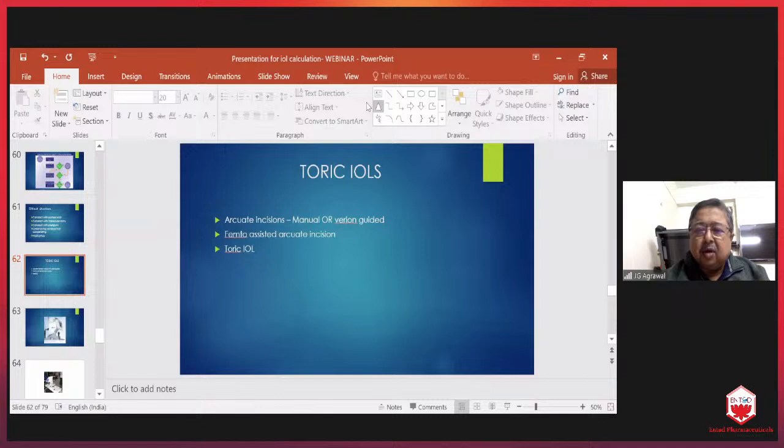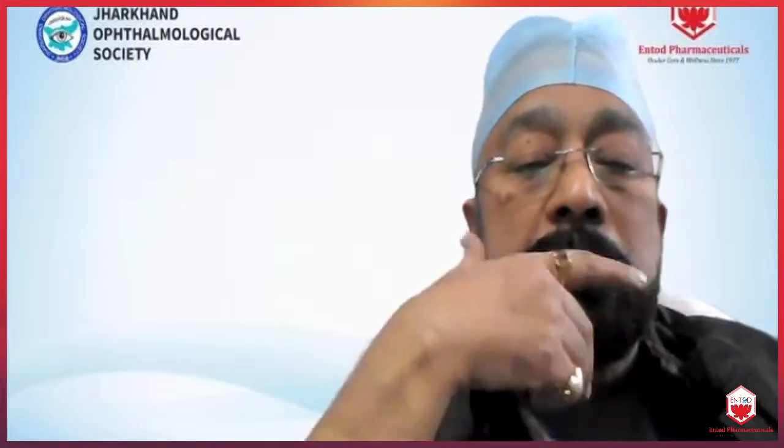Thank you, Dr. Kashyap, for your elaborate presentation on biometry. Actually, there are two aspects of biometry. First is the ocular measurement. Another is the formula which should be applied. First we go for the ocular measurement. I want to ask the panelists also, Dr. Aishwarya Rajdas, whether we should go for optical biometry or stick to ultrasound biometry. Dr. Kashyap started with ultrasound biometry and stressed the need of the hour, but I think there must be some difference of opinion from your side.